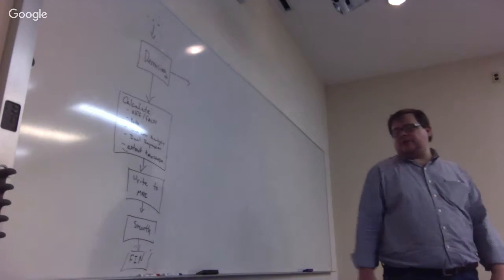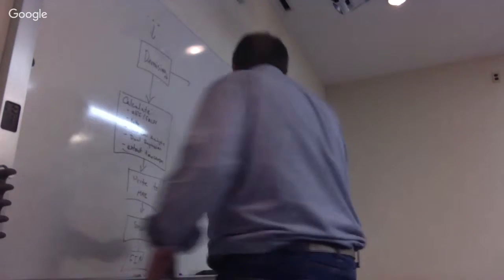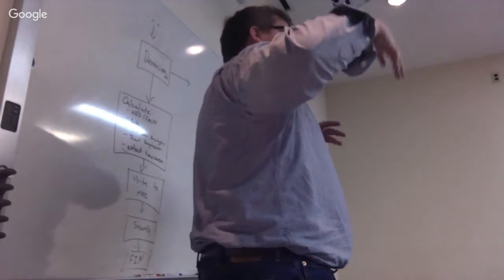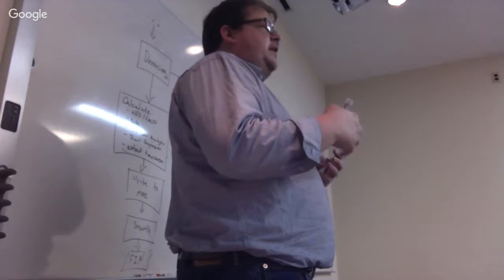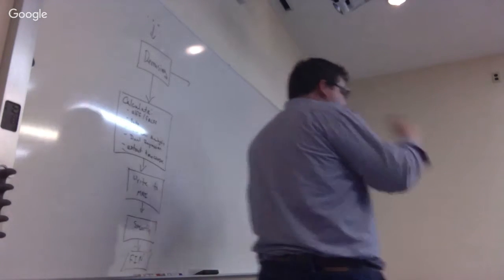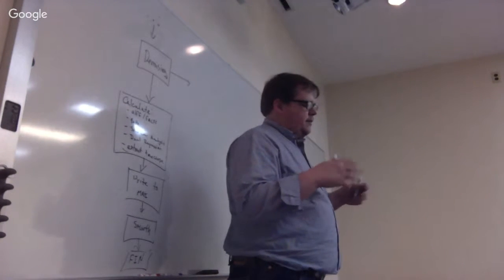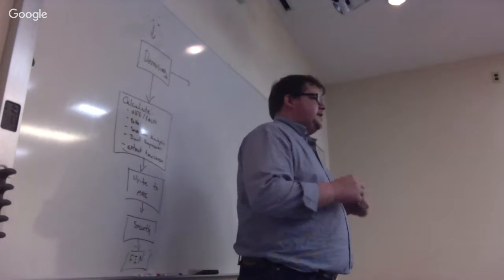And that's why we do that smoothing. So another interesting aspect: remember I said that we want to improve the functional, the anatomical co-registration of these brains to one another. So the basic idea is, we do all this MNI standardization, right? We transform all the data to MNI so that they should be the same, right?